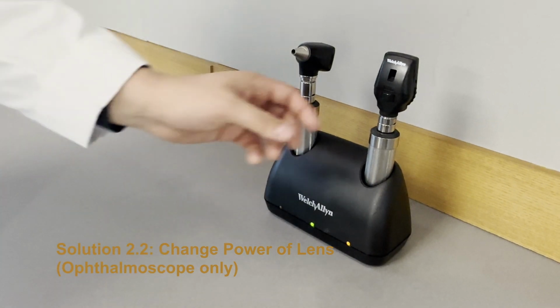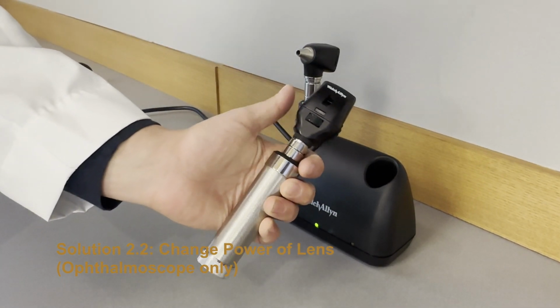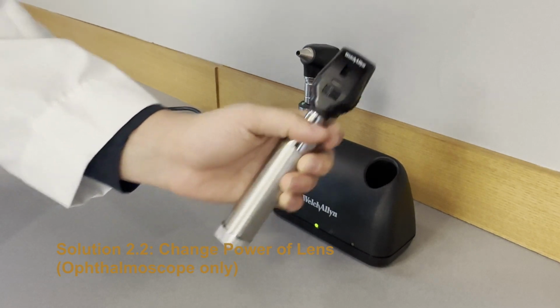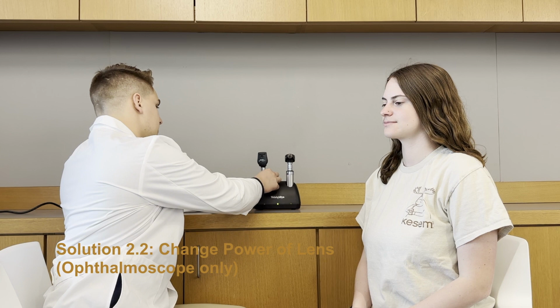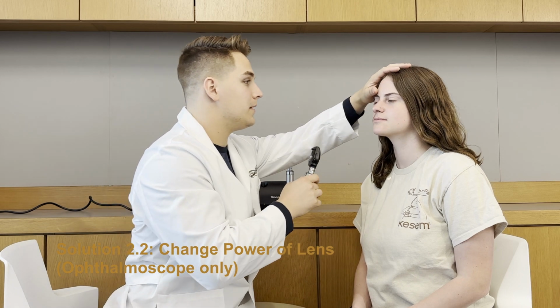Ophthalmoscopes have a diopter dial on the side to compensate for imperfect clinical vision. If the clinician has normal visual acuity, or if they wear corrective lenses, they can set the diopter dial to 0. If they do not have normal visual acuity and are not wearing corrective lenses, they can set the diopter dial to match their prescription.